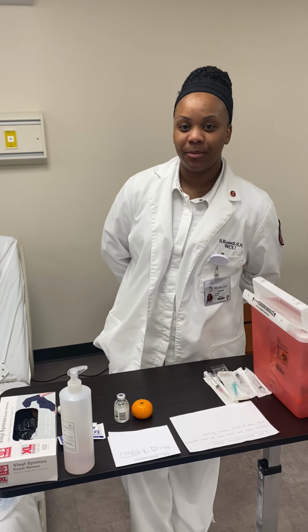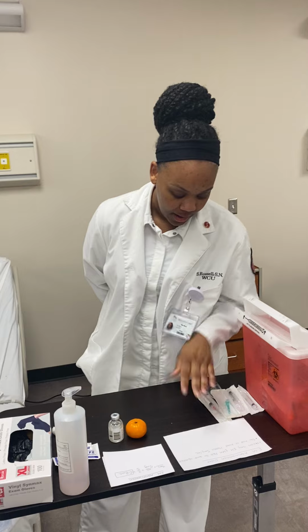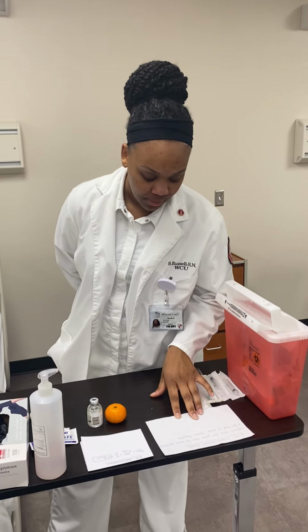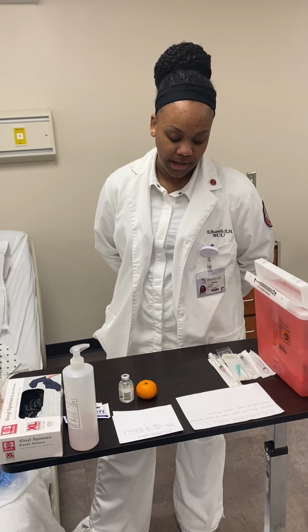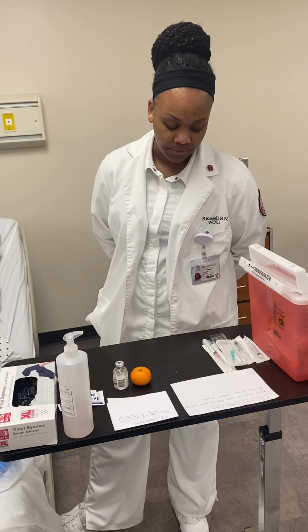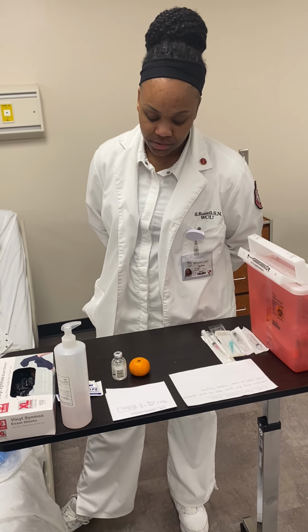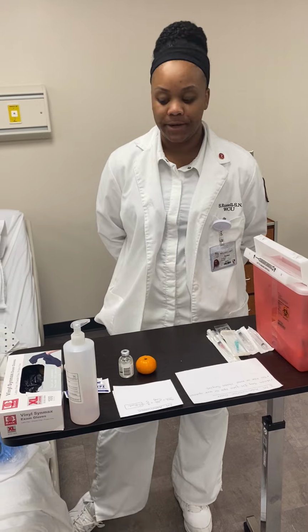Okay, so I'm going to be performing an IM administration today. The first thing that I would do is check doctor's orders against the MAR. I have Haldol 4 milligrams IM every 6 hours PRN for severe agitation. And then I have 5 milligrams per mil of Haldol on hand. So when I did the dosage calculation, we'll be giving 0.8 mils of Haldol today.